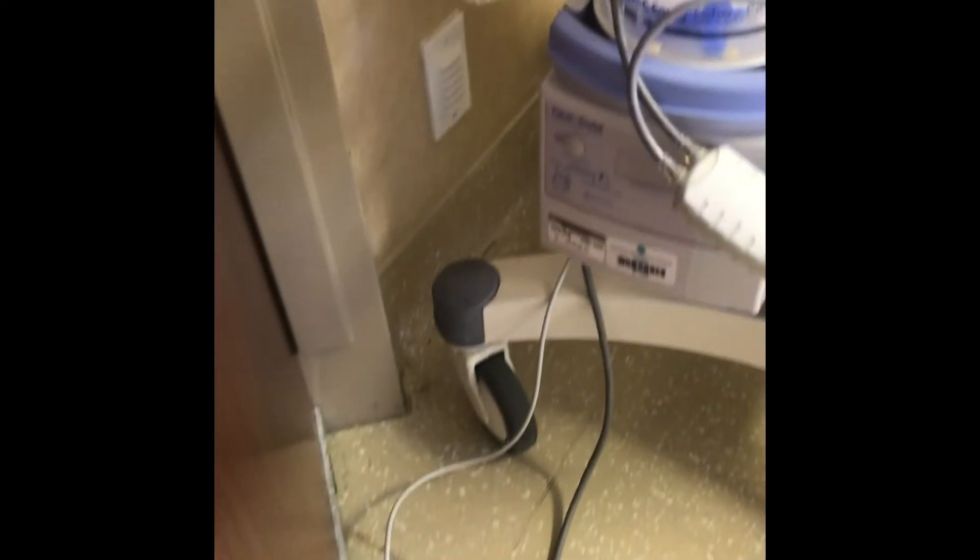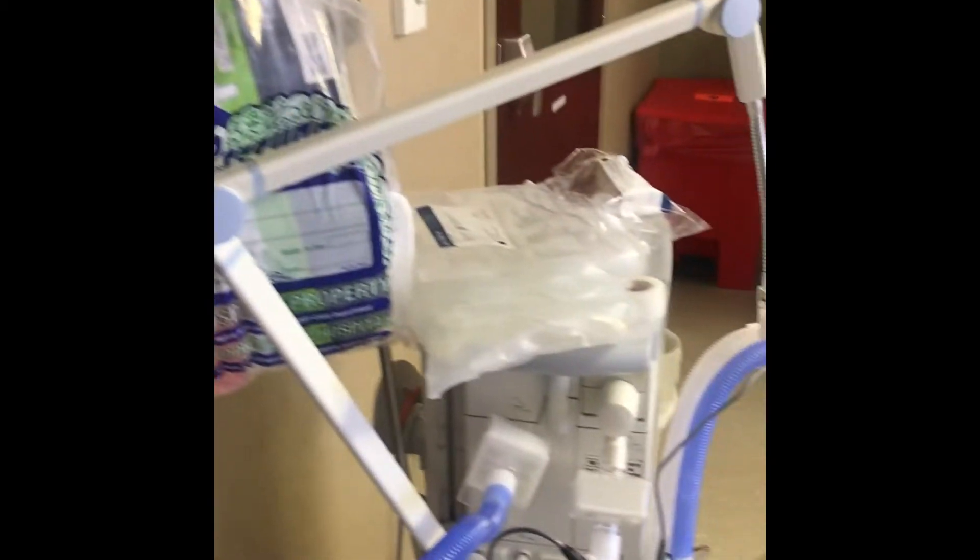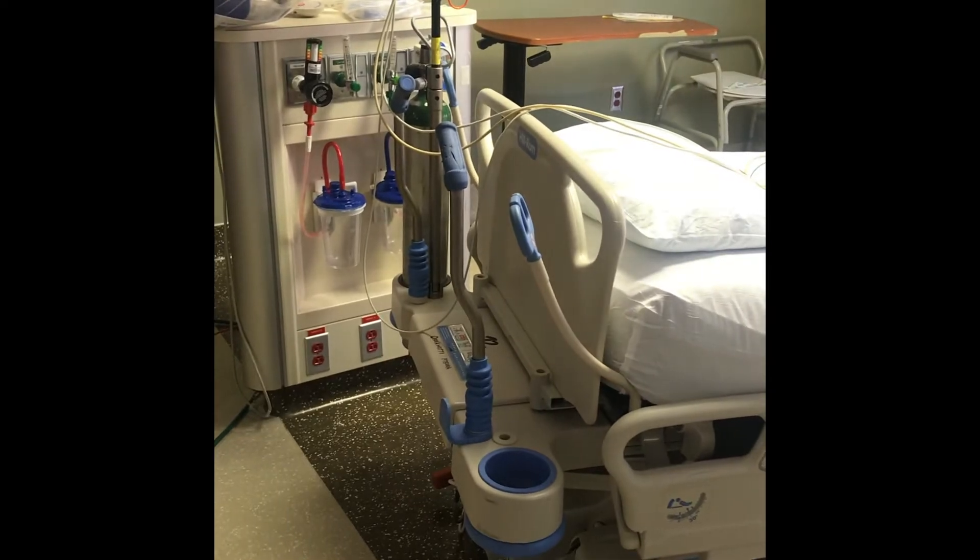The cable comes up to the back of the ventilator right there. Here's the ventilator, and the ventilator will in turn connect directly to the head of the patient's bed.